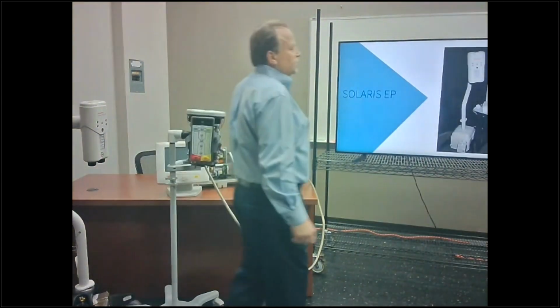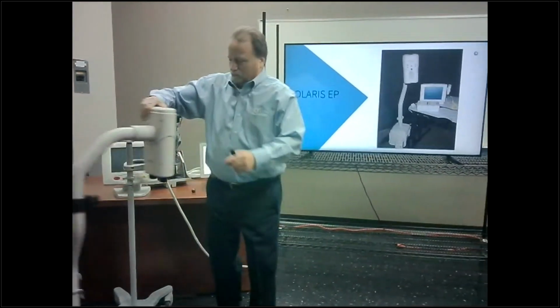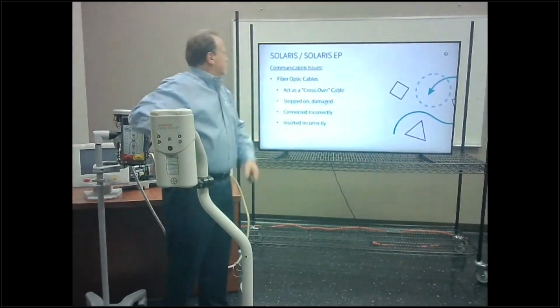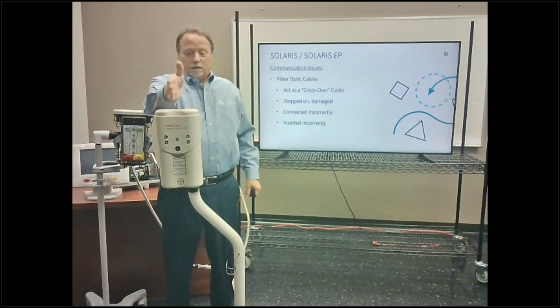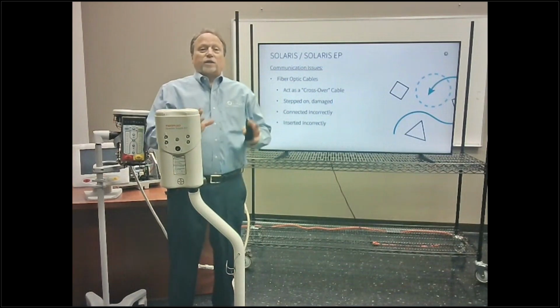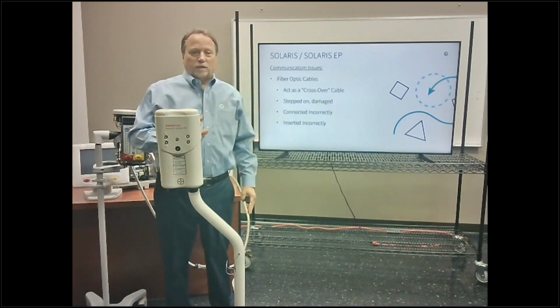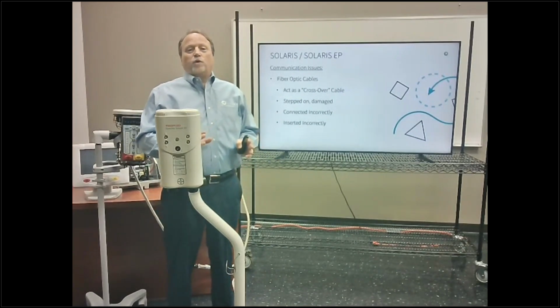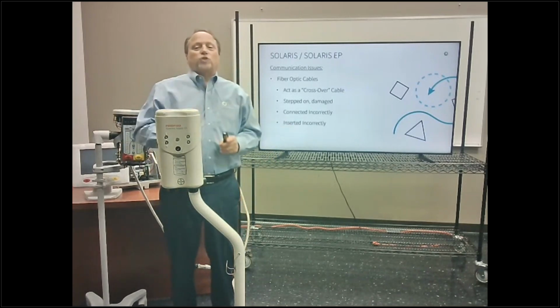Okay, let's talk about the Solaris EP. The Solaris EP has its own system talking to its display. The only communication the two have is through a fiber optic cable. And it's important that the fiber optic cable acts as the old style crossover cable.